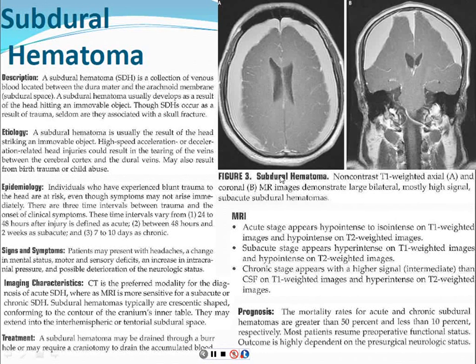You may see these on MRI, just as a follow-up. But typically, this is another thing that we usually do CT for diagnosis and follow-up.